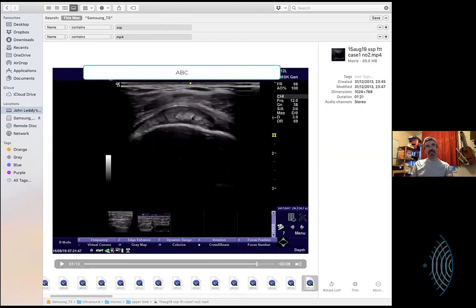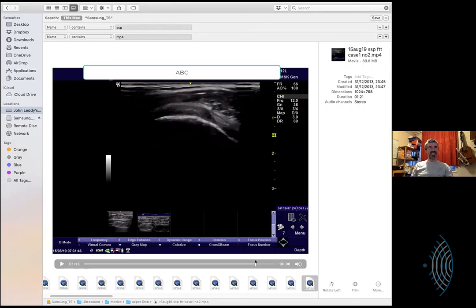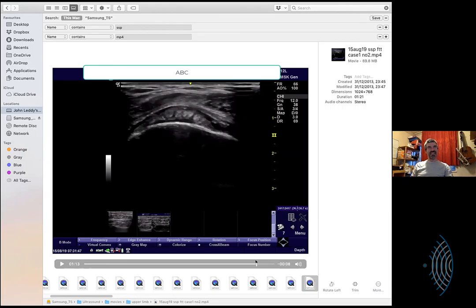I never had put that together, maybe because I just never have had the resolution. Maybe my slice thickness was so incredibly off that it just grayscaled out, John. If you think about how wide that gap is, that's a fraction. That's a centimeter. So a millimeter is half of one of those spaces. So this is less than half a millimeter wide. Yes, so you're down towards the point that's going to be less than 0.5. So you can lose that when you are, certainly if it's any smaller than that, this is going to have some edema in it. So it's going to be widened up. But you lose that when you aren't precise.